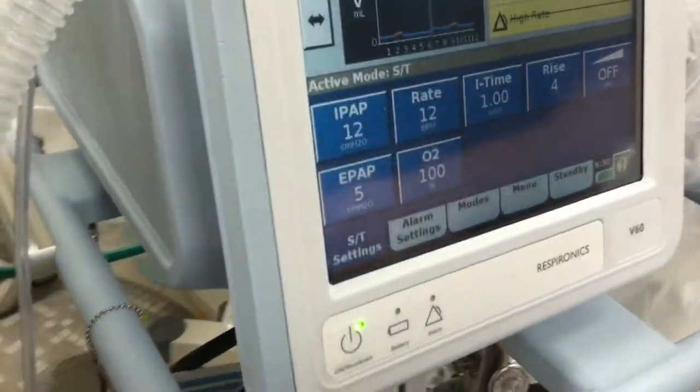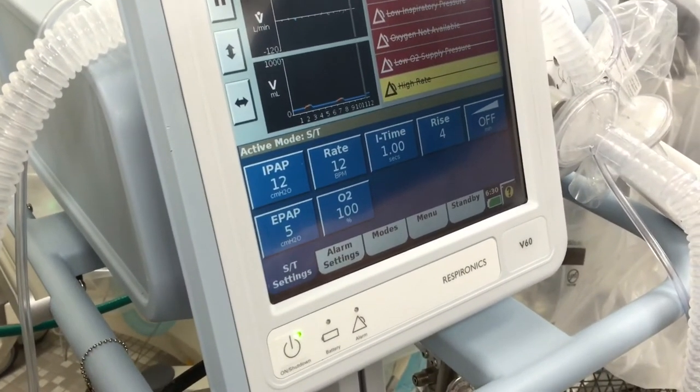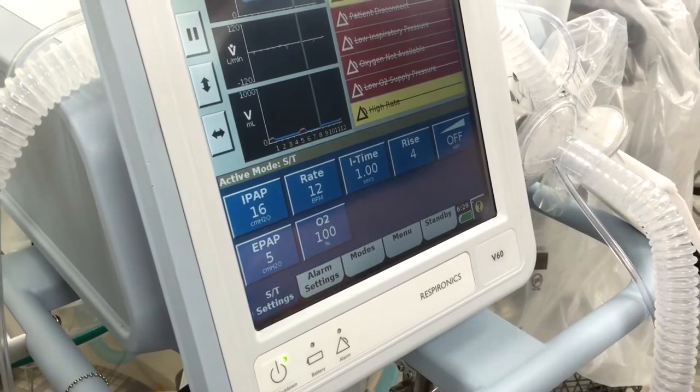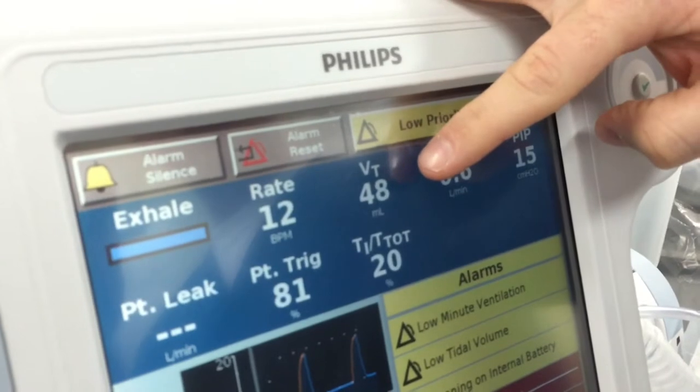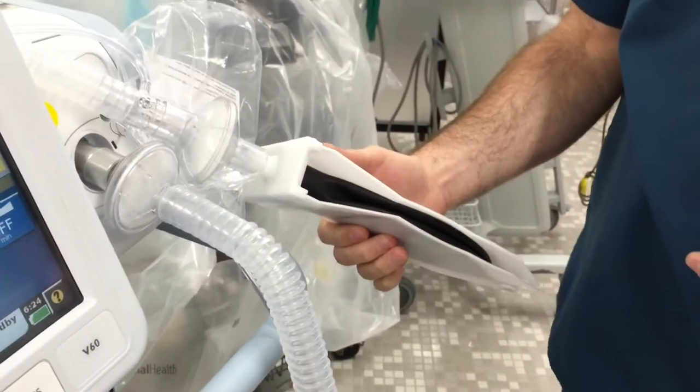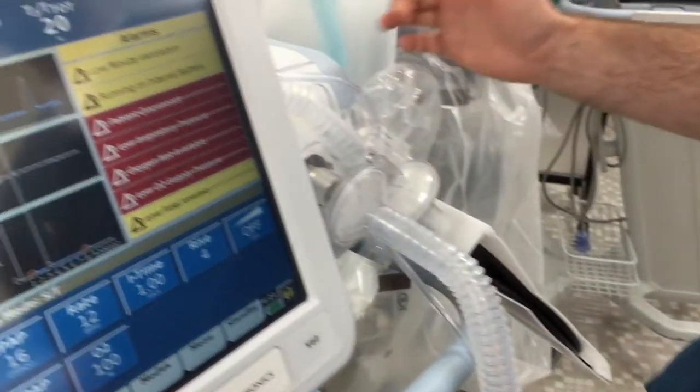The other thing to remember when using heliox on non-invasive ventilation — whether the v60 or Vision — is that your pressures and volumes are going to read lower compared to standard values. Right now the volume is reading only 48 mL and minute ventilation is 0.6. This isn't totally accurate because we're using a plastic test lung, but in clinical experience your volumes and minute ventilation will read at about half. If your patient was previously getting a tidal volume of 500 mL and a minute ventilation of 10–12 liters, they're still getting that — the machine just doesn't have software to recognize it's using a less dense heliox gas. Don't document these displayed volumes as accurate.